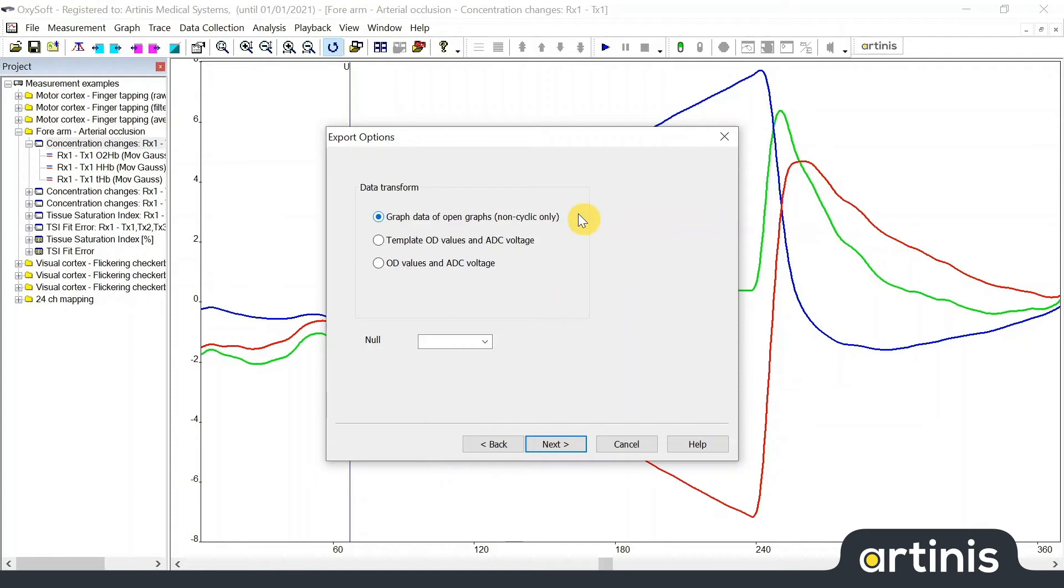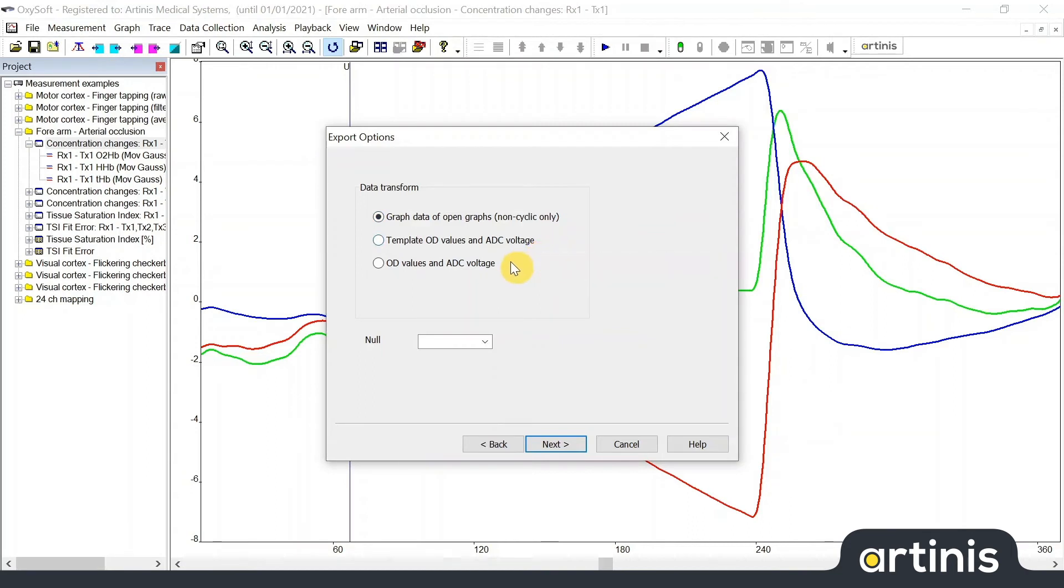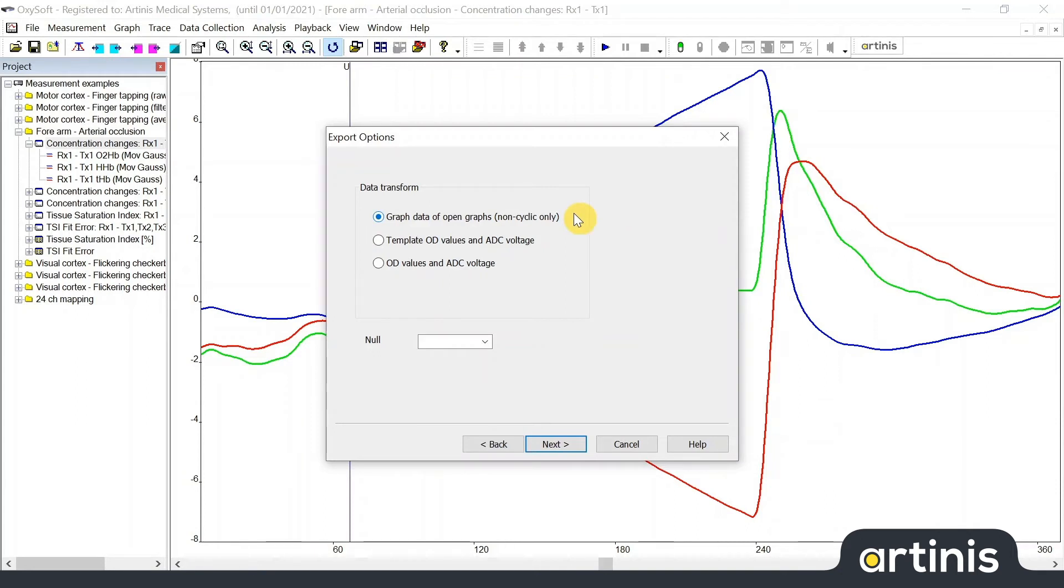You can choose to export the graph data of the open graphs, the template OD values and ADC voltages, or the raw values. We recommend using only graph data of open graphs for normal applications. This will export the measured concentrations. OD values and ADC voltages are only useful for special applications. Make sure you have all graphs with data open before you start the export.